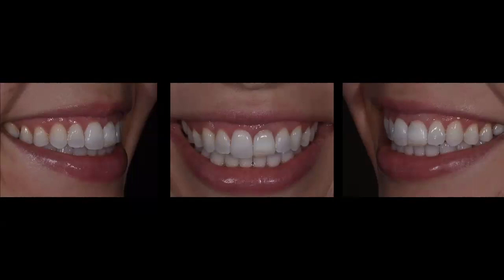Now, for this particular patient that I'm going to share with you today, one of the things that really hit hard for me when I was reviewing this case was her willingness to try to keep this tooth. She wanted to keep the tooth. You can see that she has a high smile line, very beautiful teeth, and a very highly aesthetic case. The tooth that has the internal and apical resorption is tooth number 9. And if you look at the photo, most likely this was due to a fracture.